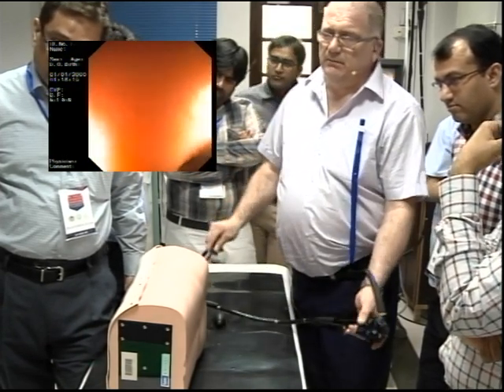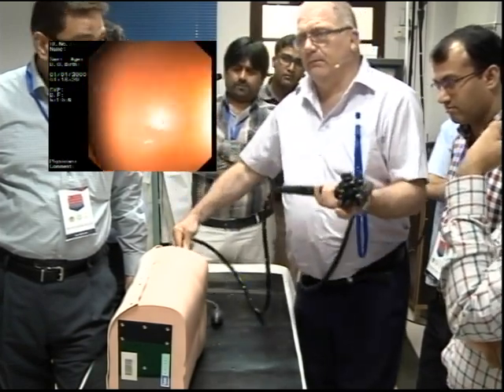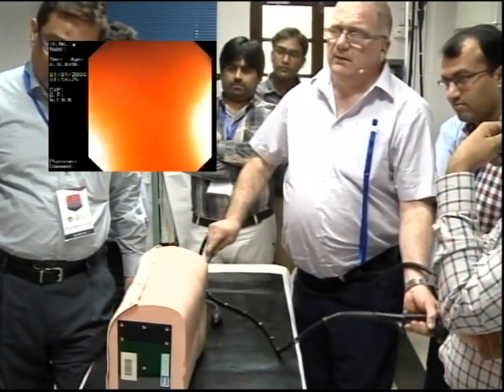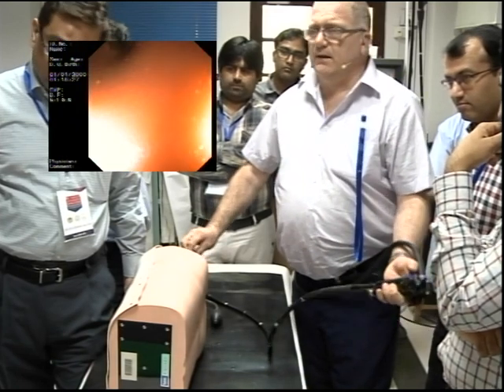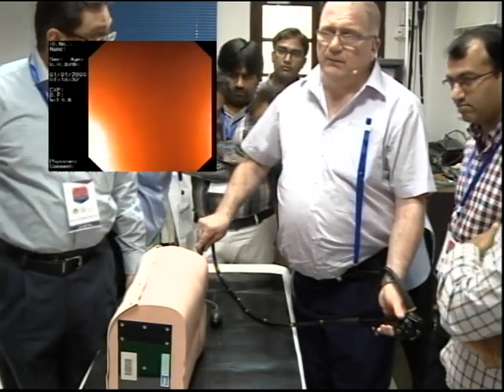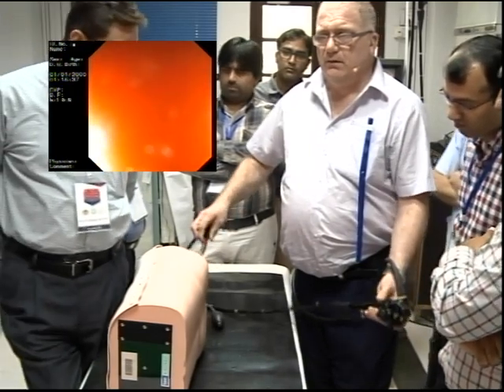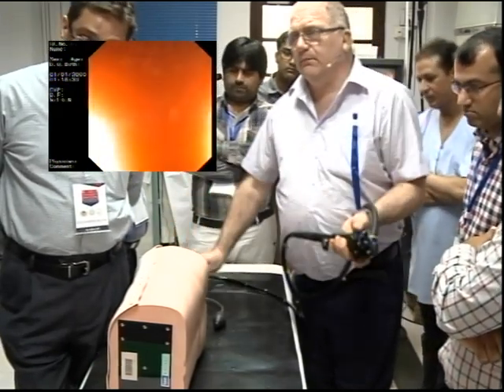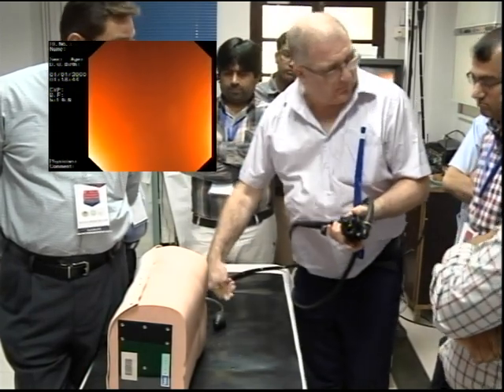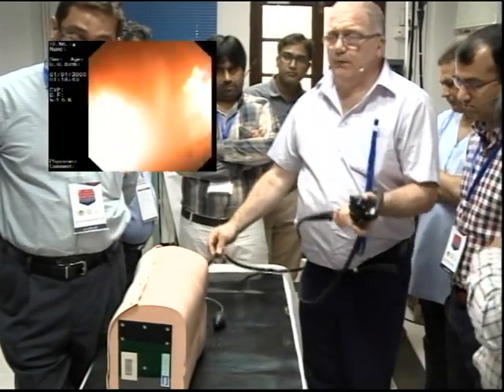Let it come round, and then back. So there's a lot of scope in there. We just go past that area again, and then just let it sit — and that's it. The lumen and the scope itself on these mannequins becomes very stiff after a period of time, but the scope will actually go round. But if you're not using it correctly — pushing down, holding it too high — it does the opposite. It will actually take the torque off the scope.